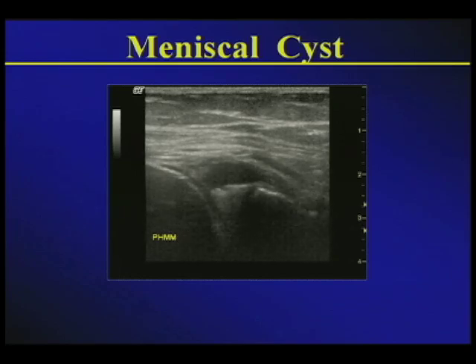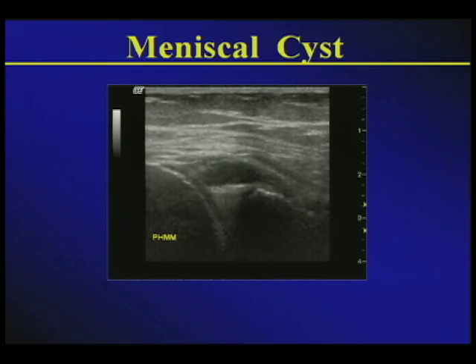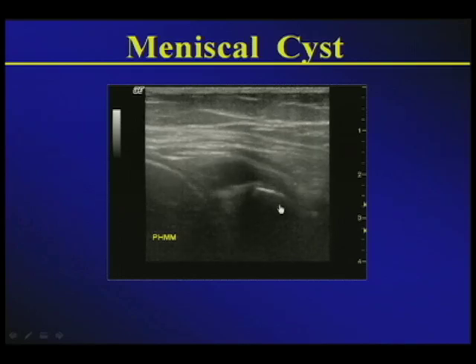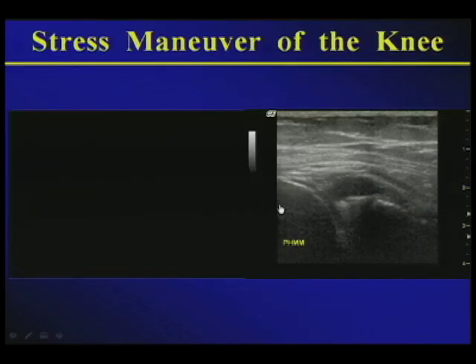It is with ultrasound that this lesion probably is better diagnosed than with MR. That is because this case from Dr. Minh Vu from Ontario, Canada, shows us that like an ice cream cone, you have a hypoechoic collection of fluid, representing the scoop of the ice cream, over the triangle of the sweet cone. And notice that with dynamic imaging, we're able to create and confirm that there is indeed a tear of this meniscus, creating this cyst opposing and above it.